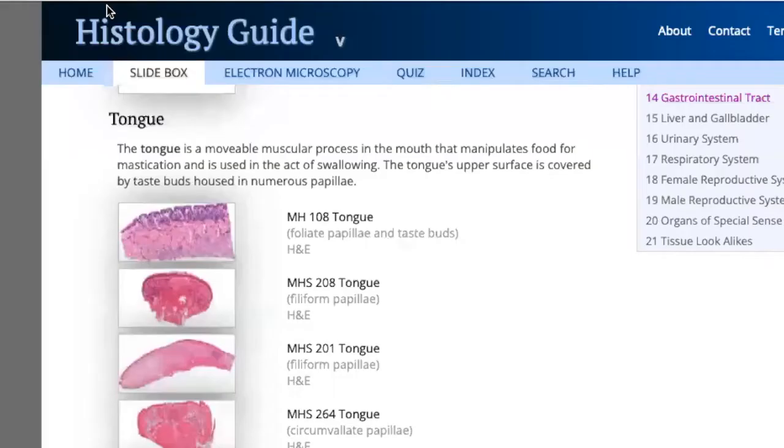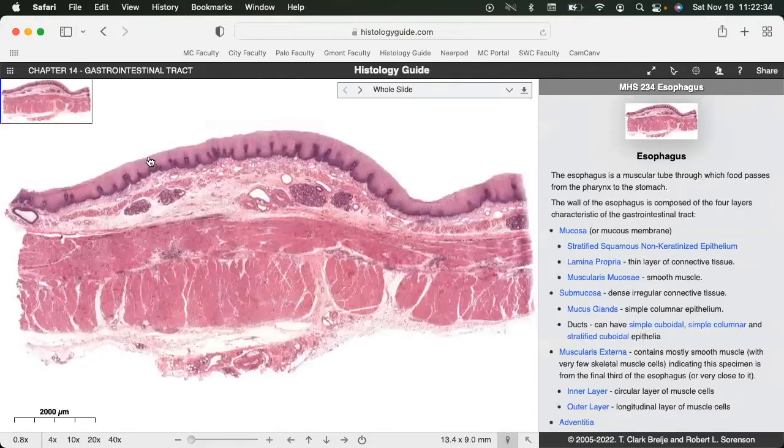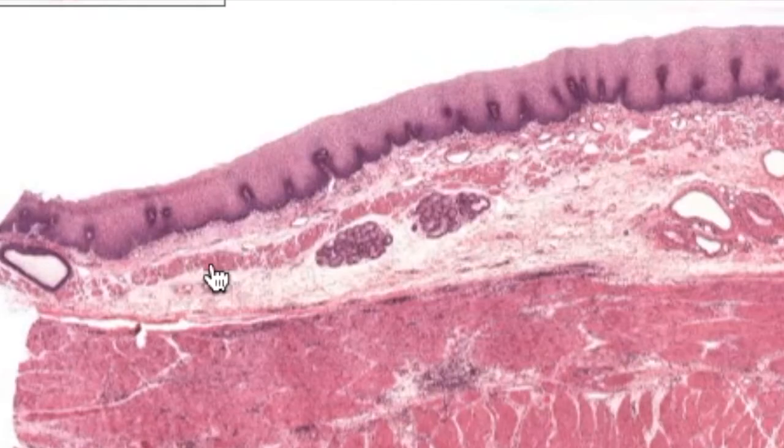over there. So going back to the next region over there, we're going to move into the esophagus. This is a longitudinal view over here with the stratified squamous that you could see from afar. You can see the stratified squamous. You can make out this muscularis mucosa. So this would be the region of the mucosal layer with the lamina propria in between there. And then this would be the submucosa.